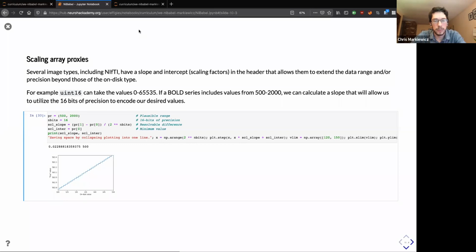Okay, there is a question. What is the use case for NiBabel for these functions? Is it for those creating software, or needed for those who use routine analysis or loading data for machine learning processes? Okay, maybe I can discuss that a little bit later after this, just to not lose the thread, but I will get back to that. That's a good question.